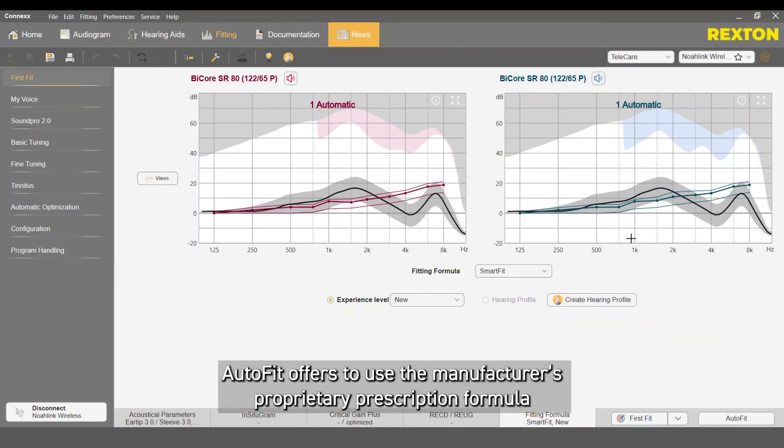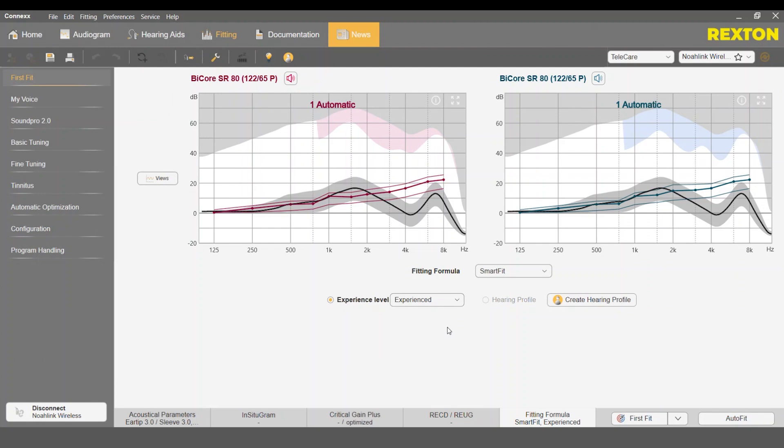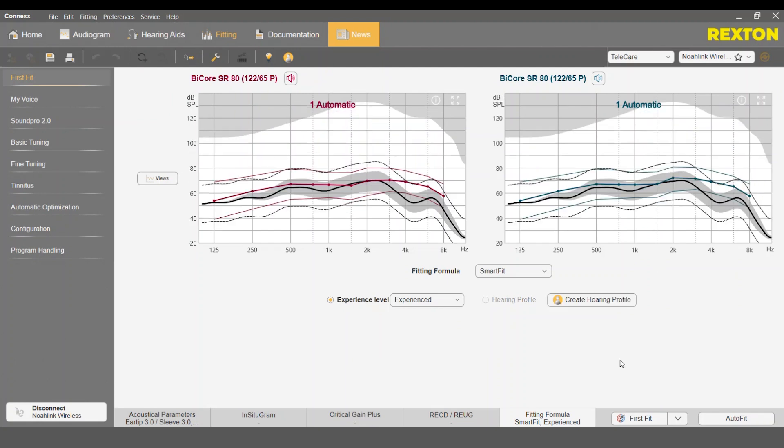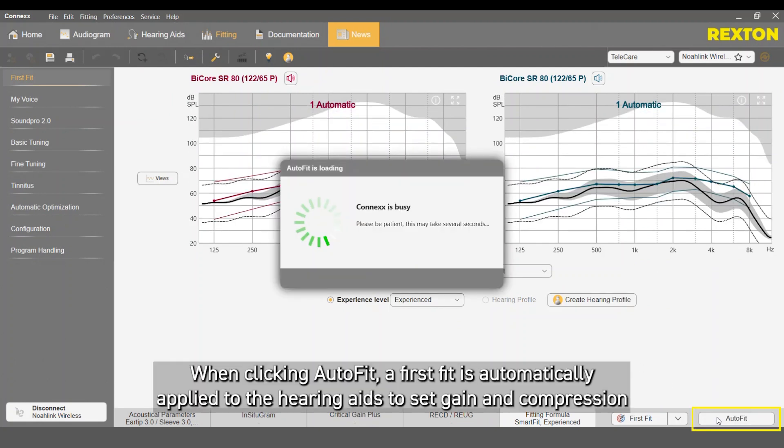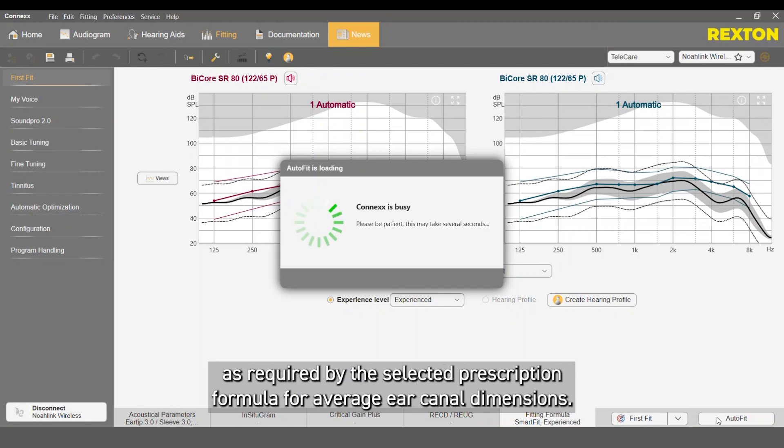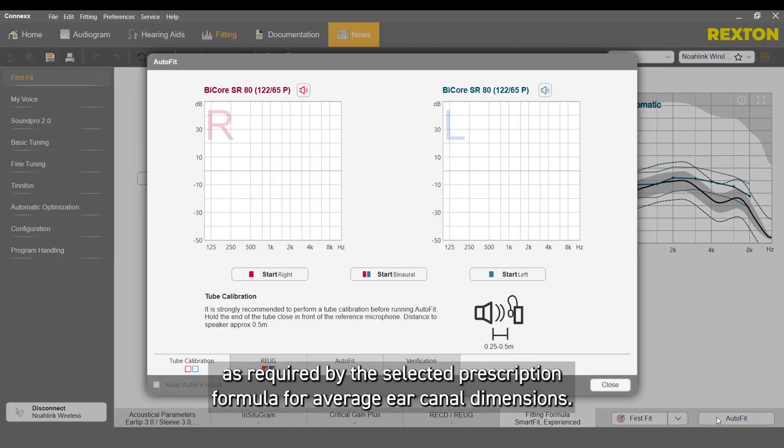AutoFit offers to use manufacturer's proprietary prescription formulas, which are not supported in commercial probe measurement systems. When clicking AutoFit, a FirstFit is automatically applied to the hearing aids to set gain and compression as required by the selected prescription formula for average ear canal dimensions.